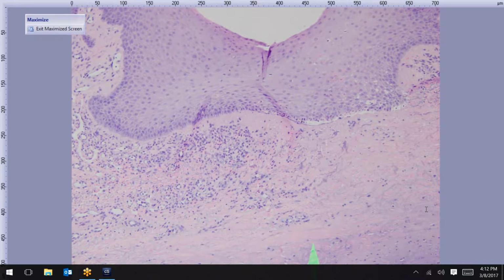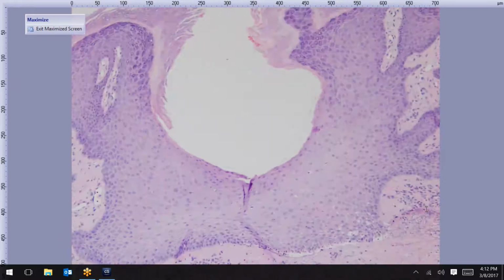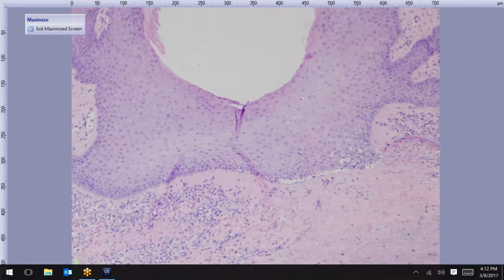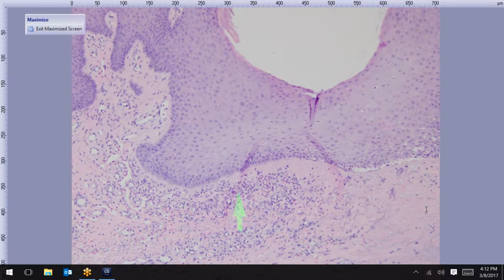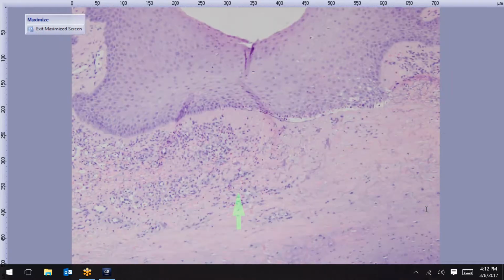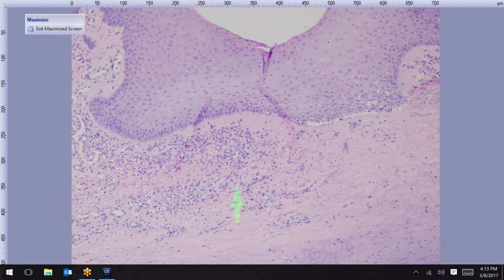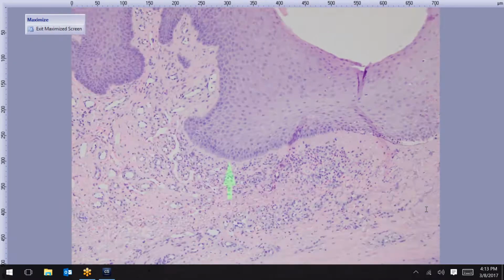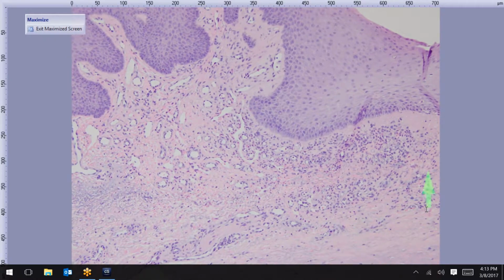If you're not given this piece of cartilage in the sample, you really should still be able to make the diagnosis. You get this kind of collagen degeneration. Question here: I don't see any fibrin or granulation tissue. Yeah, it all can vary, and really more than just frank granulation tissue. What I often see is a component of granulation, just the vascular proliferation, and it often does line up around the sides and underneath here, like this right here.